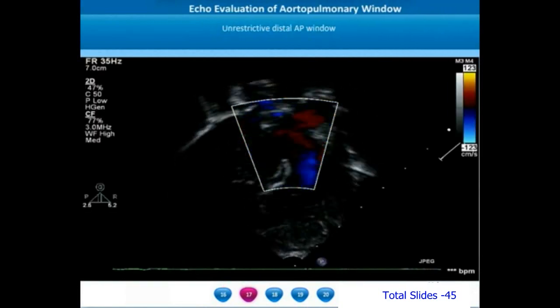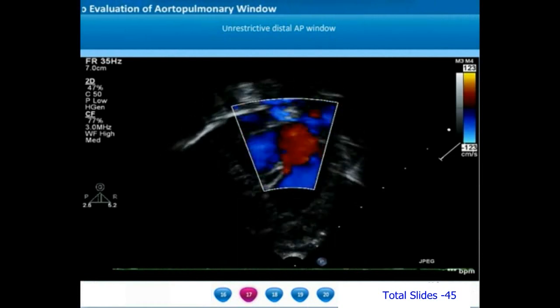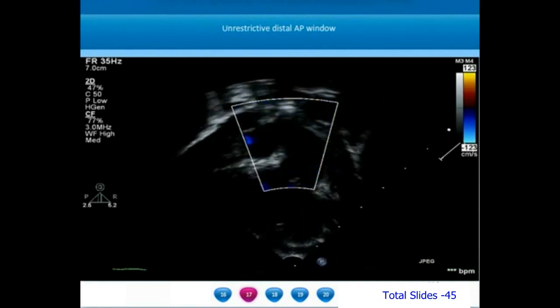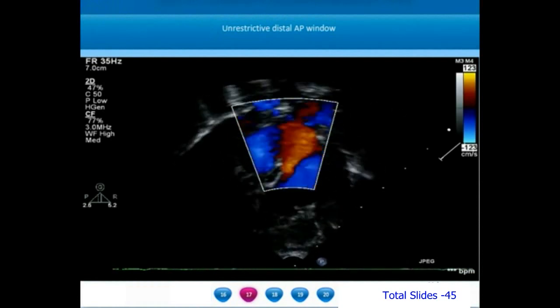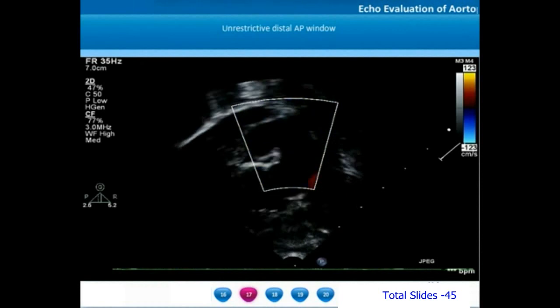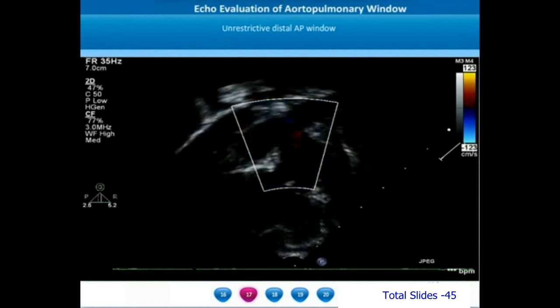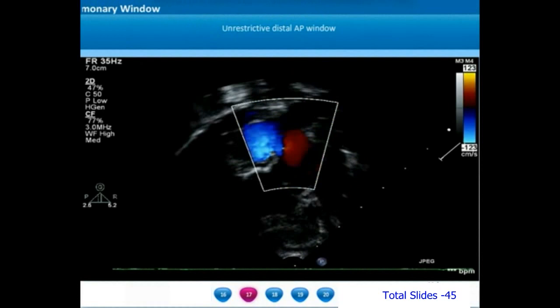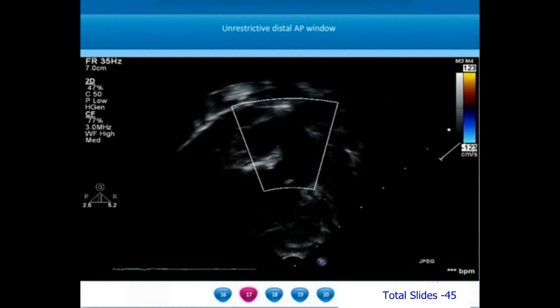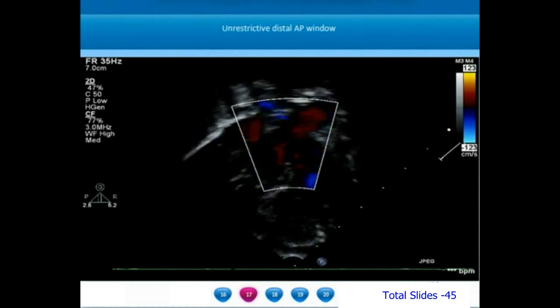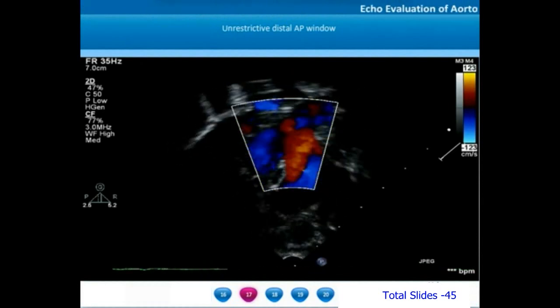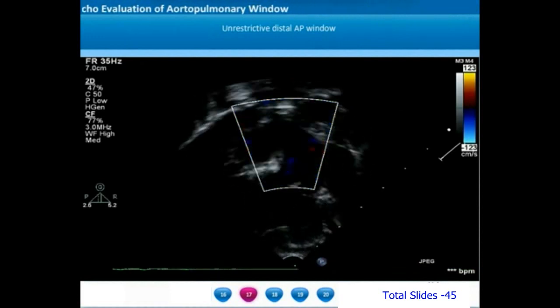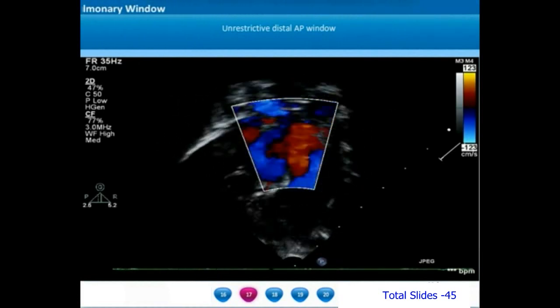Having seen a proximal restrictive AP window, we move on to another example of an unrestrictive large distal AP window. We are viewing from the AP window view and making a sweep anteriorly to visualize the right ventricular outflow tract. In this modified view with a significant anterior sweep, we see the right ventricular outflow tract, the pulmonary valve, and the main pulmonary artery. On the left side of the screen are portions of the ascending aorta, and distally the main pulmonary artery and ascending aorta almost merge together.